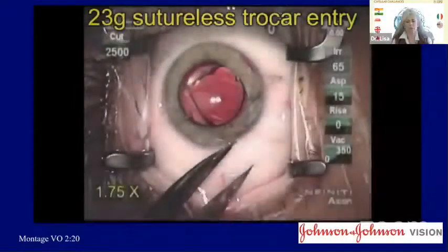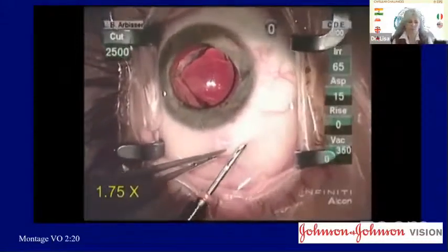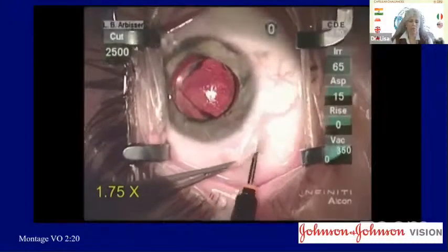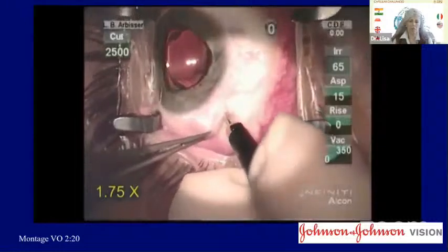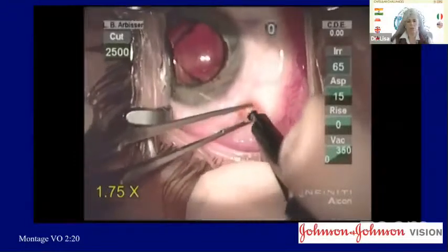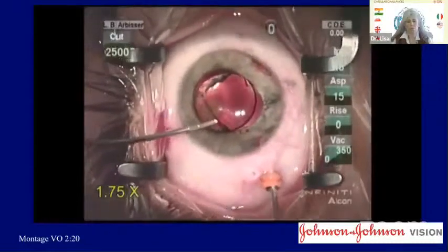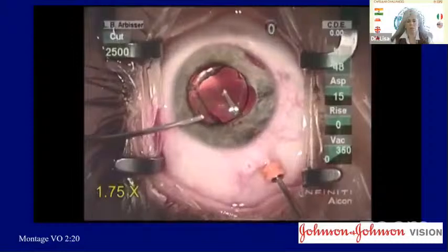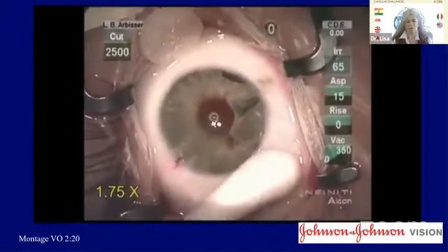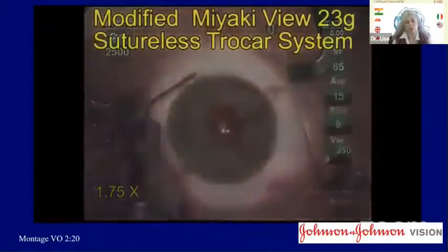Next, we're going to do a trocar system insertion, and we're going to pull the conjunctiva so it's not coincident. We're going to go 3.5 millimeters back, limbus parallel, to make a scleral tunnel. The appropriate angle is 30 degrees to the sclera, and then enter completely. Here it's a little extreme, that the collar pops backwards so that we're sure we have not broken the ceiling or the floor of the scleral tunnel, so that when we come out we can apply direct pressure. I'm told that it's preferable, rather than the pressure that I've applied here, to actually crush it with the tip of the trocar in order to be sure that there is no incarceration of vitreous. This should seal nicely without any bleb.